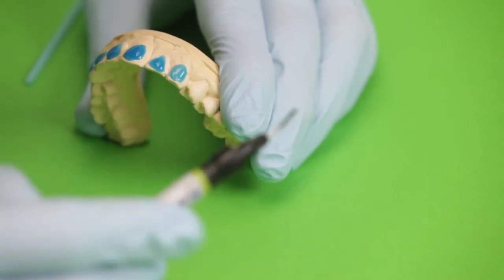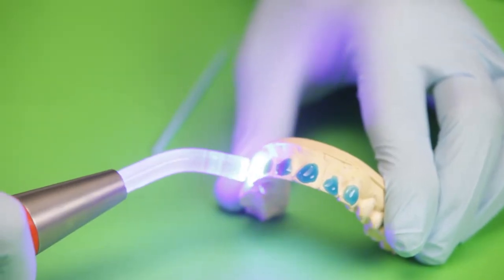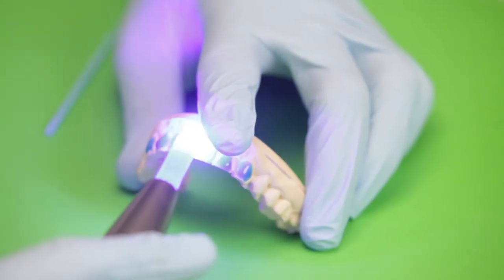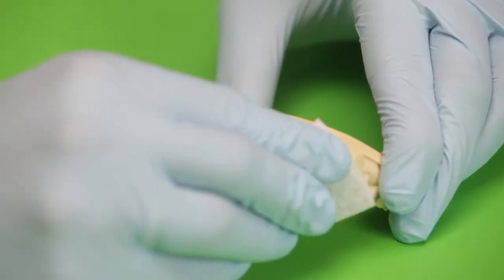You can then light cure the resin. I'll just wipe it with some alcohol swabs to remove the oxygen inhibited layer.